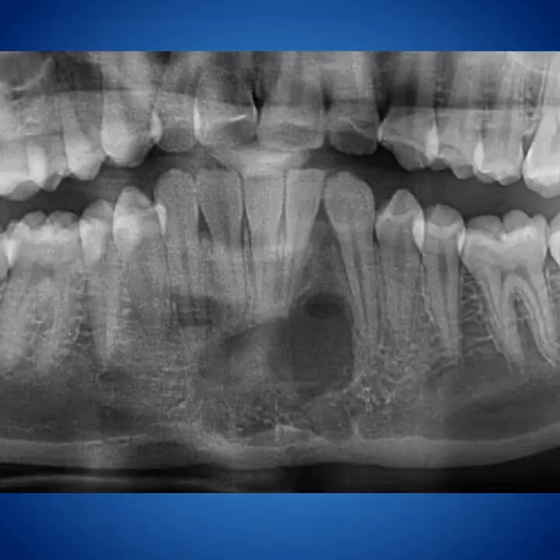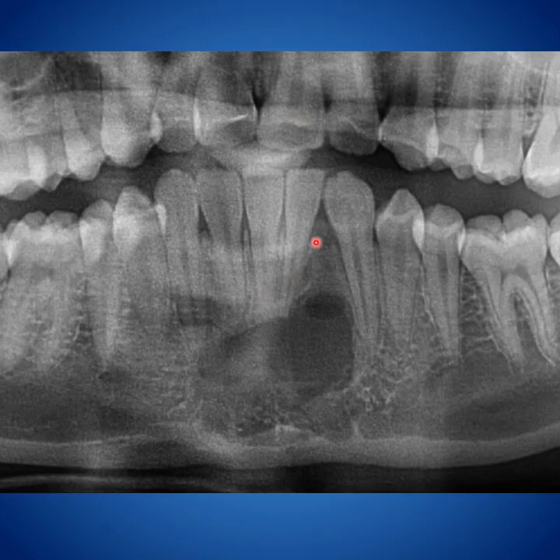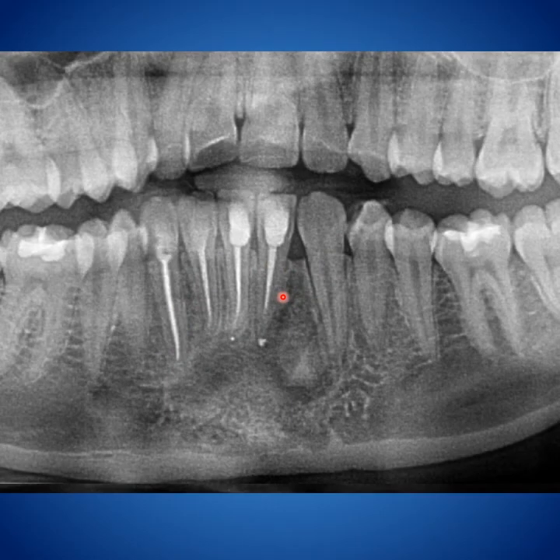As we can see here, this is a very big lesion that has made these teeth, lower anterior teeth, non-vital. But when I did obturation to the 4 anterior teeth with extrusion of the sealer, as you can see here, after some time, total healing happened.